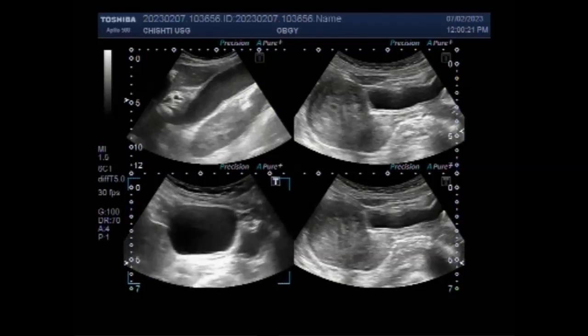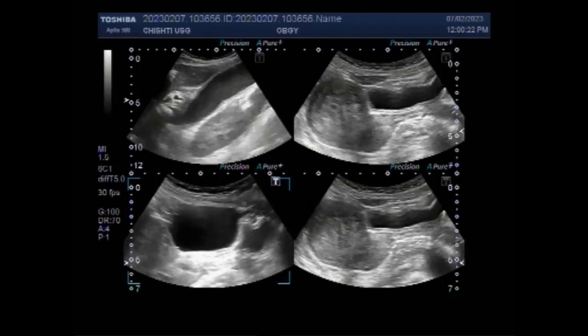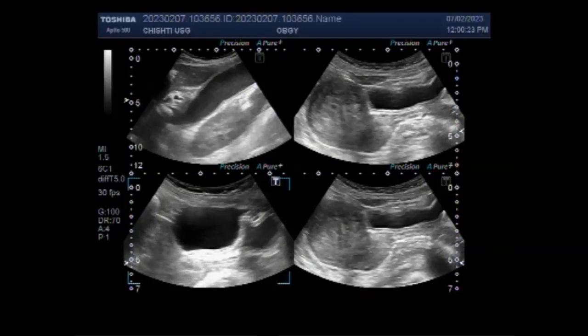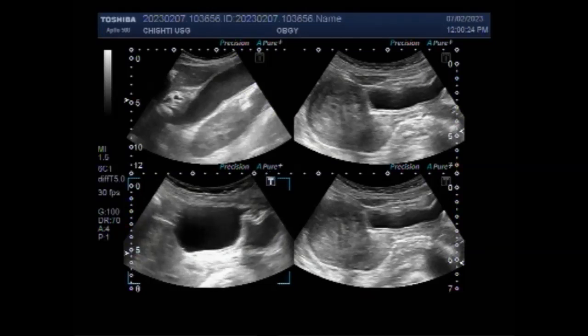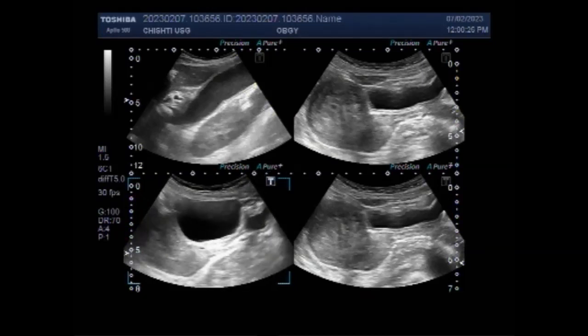Now you can see the large ovarian cyst — specifically the left ovarian cyst.